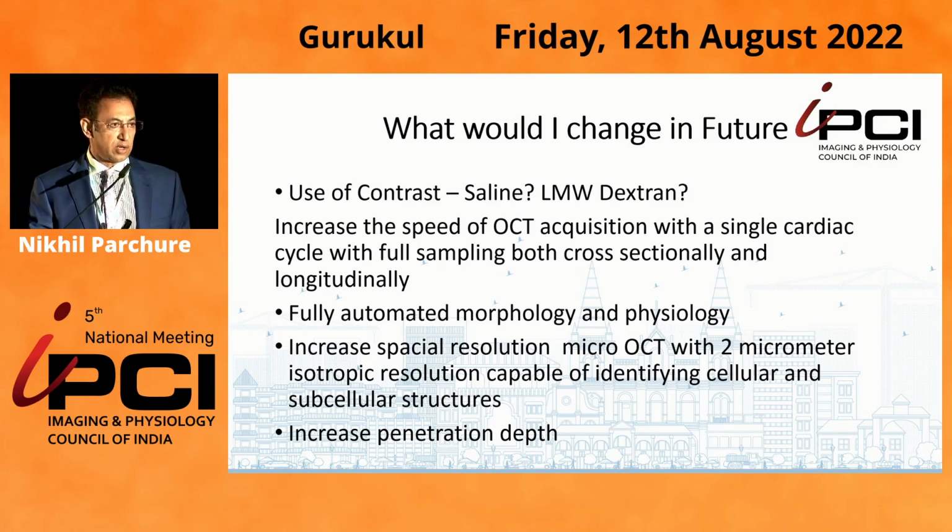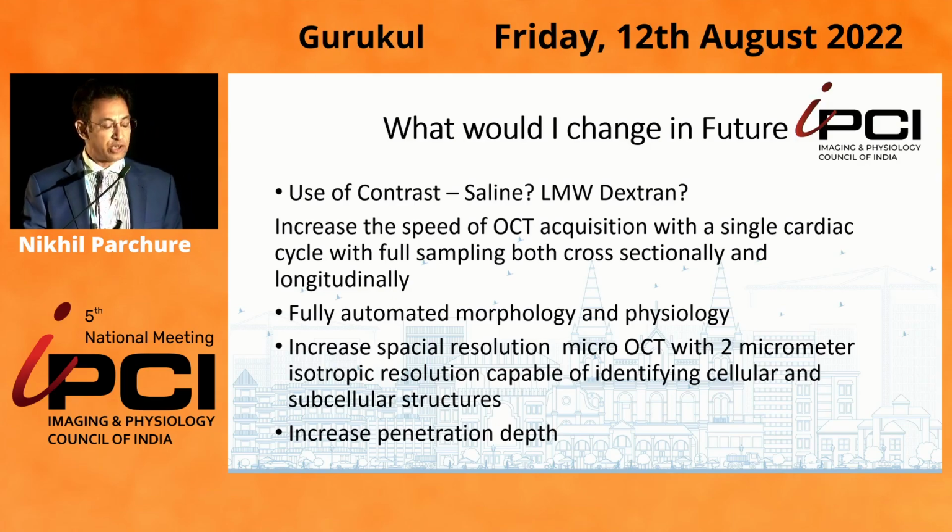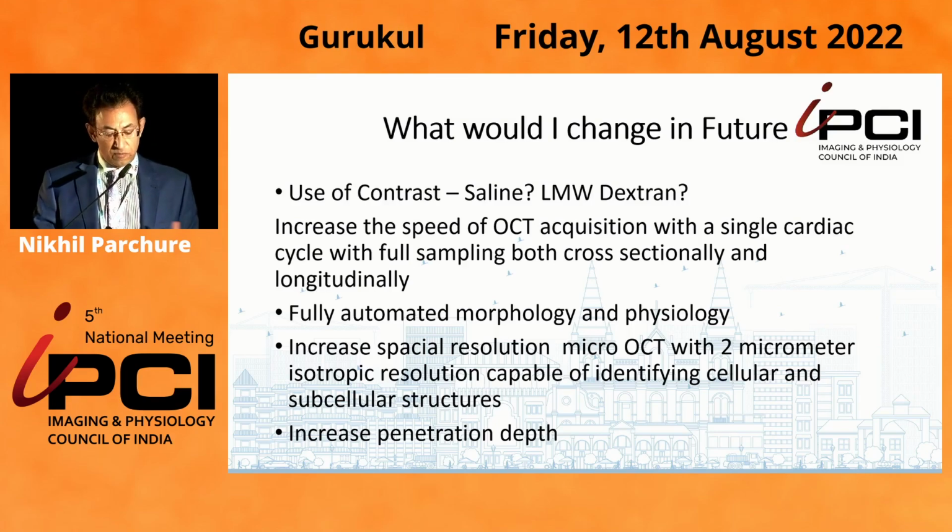Next, an exciting technical development is fully automated morphology and physiology without causing hyperemia. Increase the spatial resolution in terms of micro OCT with 2 micrometer isotropic resolution, capable of identifying cellular and subcellular structures, and increase penetration depth.